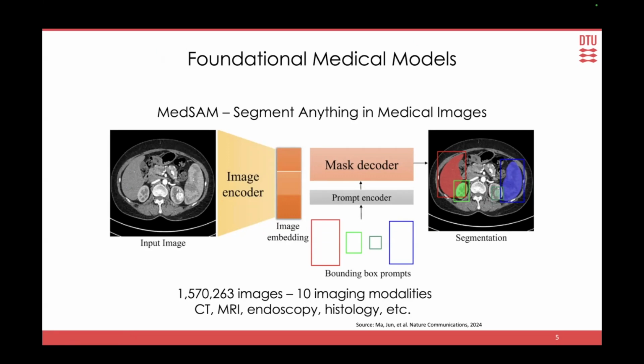When you look under the hood, you realize that what they've done for the volumetric data is that they take out slices and then make them 3-channel, because it needs to fit into the architecture and the framework of the Segment Anything Model. But nevertheless, quite impressive results are obtained by the MedSAM model as a user interaction segmentation model.